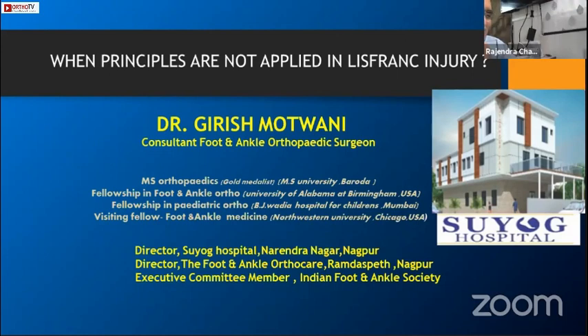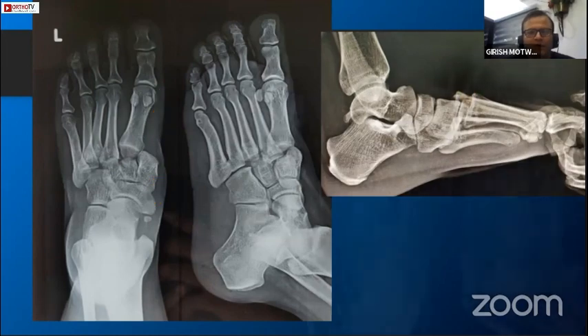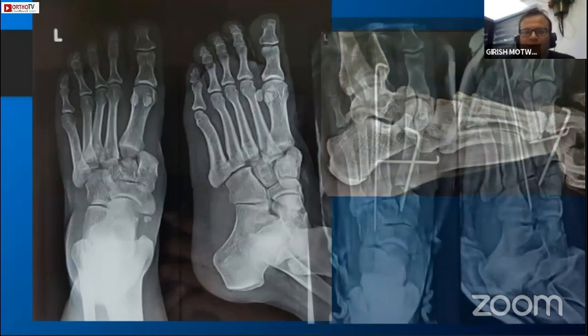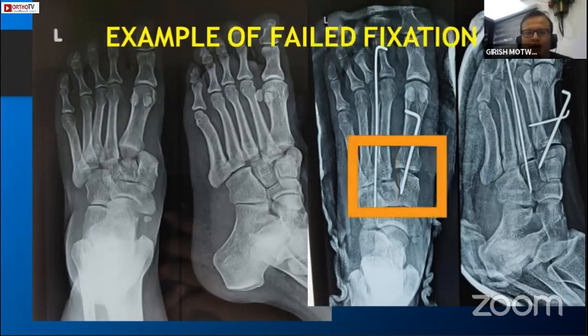As Dr. Munud has said, when you don't apply the principle of where to put a wire or a screw, what can happen - this was a 35-year-old female with a history of fall from stairs. This was the X-ray and this is how it was treated. In the post-op X-ray the lines are deviated; there is a clear-cut rotational instability of the first and second TMT joint. Look at the articular congruence - the lines are not parallel and there is a big void.